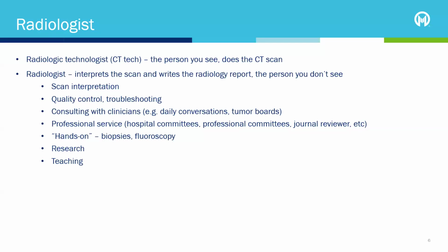But other things would be quality control of the imaging modality. There are standards that have to be met by various accrediting organizations and internal standards that we set. Daily troubleshooting of things that come up, whether it's issues with scheduling or patients having a reaction to a contrast agent, et cetera. Consulting with clinicians, and that's the radiology term for other doctors. It goes back to the day when doctors see patients in clinic and radiologists don't, so it's a blanket term for a non-radiologist.